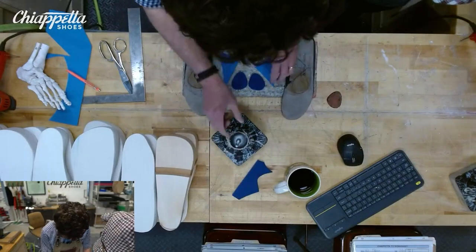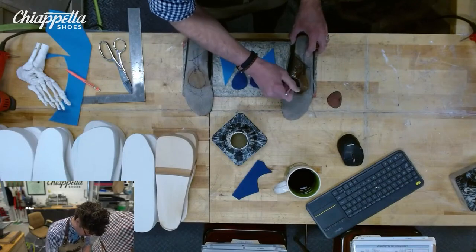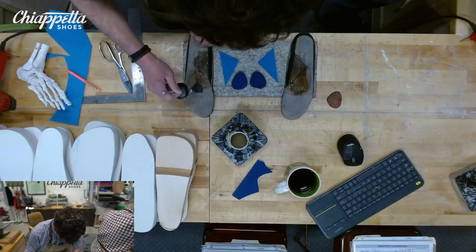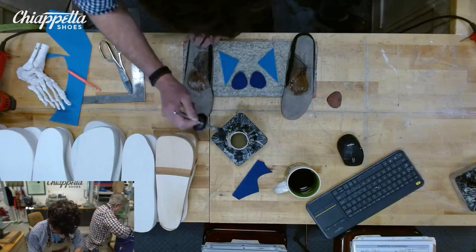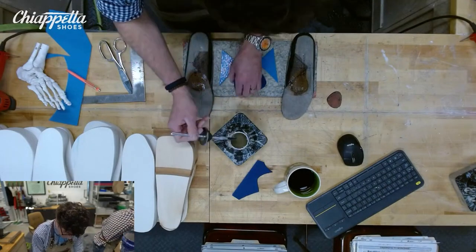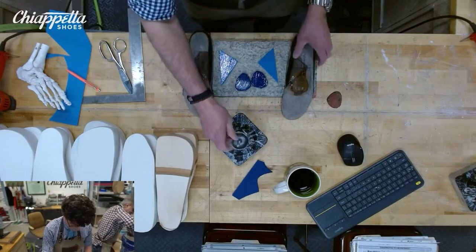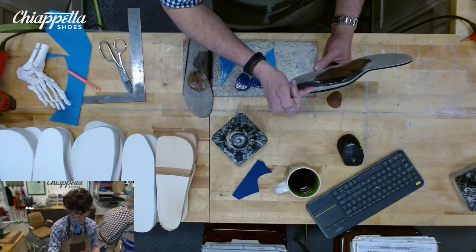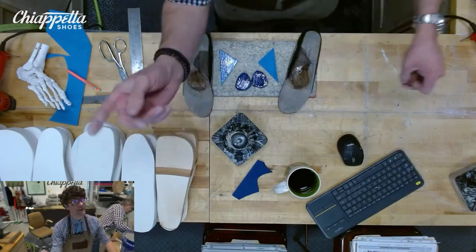So we're going to glue these puppies up. So again, the scaphoid pad, standard alignment. We are doing a blue multi-cork. I've said it multiple times on here. It's from JMS. It's J-cork. It's a 65 durometer. I like it because it's a little firmer compared to most other multi-corks out there. It's only 1/8 of an inch, so it's on the thinner side. But we have THK, which is a thin thermoplastic we get from Forestali out of Italy, and then a multi-cork that's a 55 durometer, firmest on the bottom. So we're going to take a break for a sec, and we'll be right back, folks.